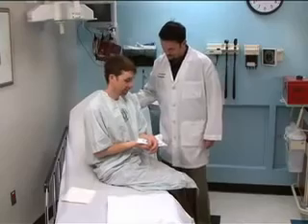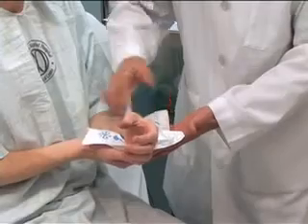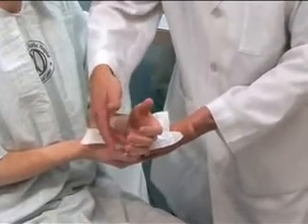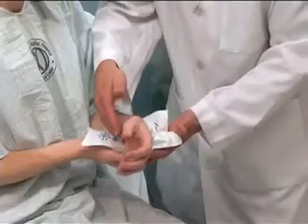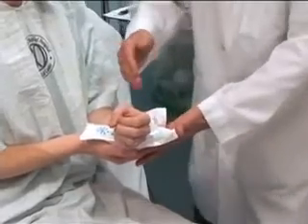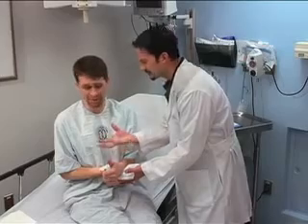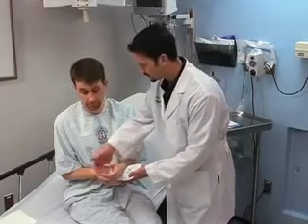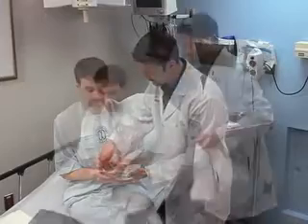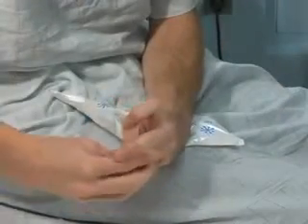Before placing a splint, carefully examine the injured extremity. Failure to expose the injury site fully may result in unidentified injuries and subsequent poor outcomes. Evaluate pulses, motor function, and sensory function to determine whether emergency intervention or evaluation by a specialist is necessary. Treat skin or soft tissue injuries appropriately before placing a splint. Analgesics or anesthetics may be necessary to control pain during the splinting procedure. Place the patient in a comfortable position that allows adequate access to all sides of the injured extremity. Remove all jewelry from the involved extremity before beginning splint placement.